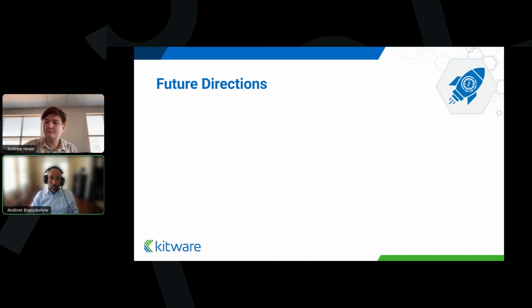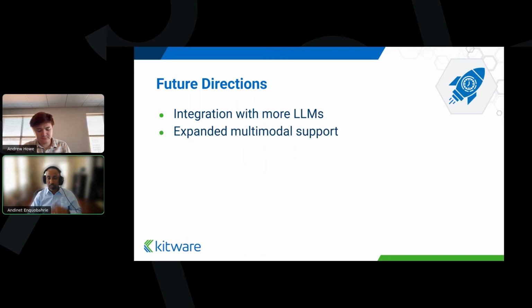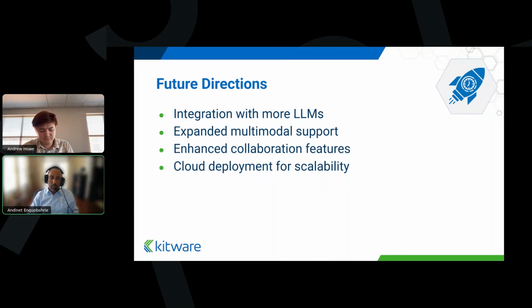Some of the areas that we're planning to work on: add more support for other LLMs. As Andrew mentioned, we integrated MedGemma a while back, but there are other multimodal LLMs being released, so we'll be integrating them. Then expansion of this multimodal support with EHR data as well. Adding features within VolView for collaboration. One of the researchers or clinicians could be doing segmentation and generation, and we want to find a way for other collaborators to review what was done. And again, as we just talked about, making it easier for cloud deployment.